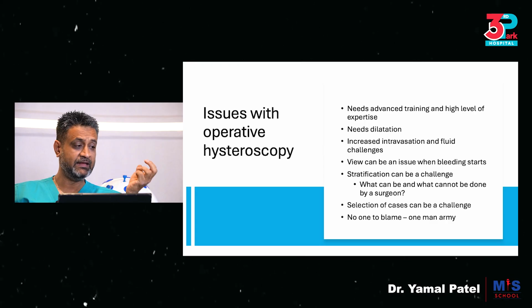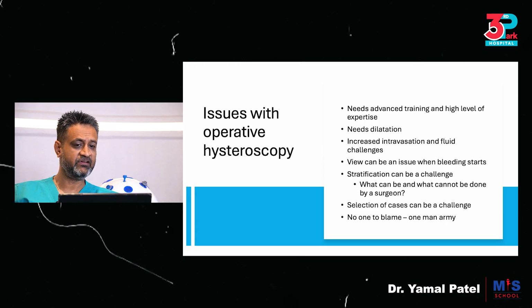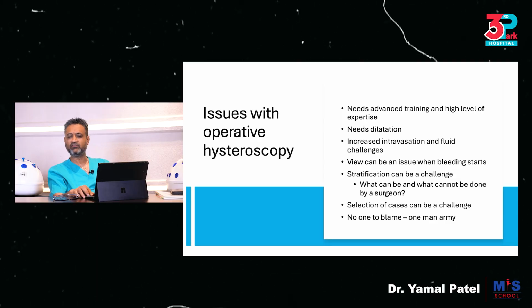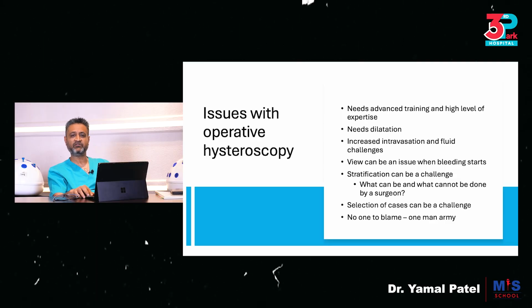Now, what are the issues we need to know about operative hysteroscopy per se? Well, it needs advanced training and a very high level of expertise. I told you it's not that easy. Operative hysteroscopy with the small cavity is something we need to look at, and this requires additional training. We also need to understand that operative hysteroscopy ideally will need some sort of dilatation. Diagnostic will not, but operative could.